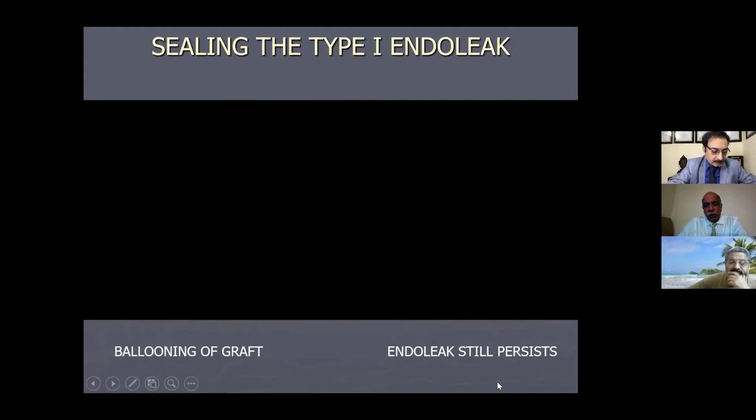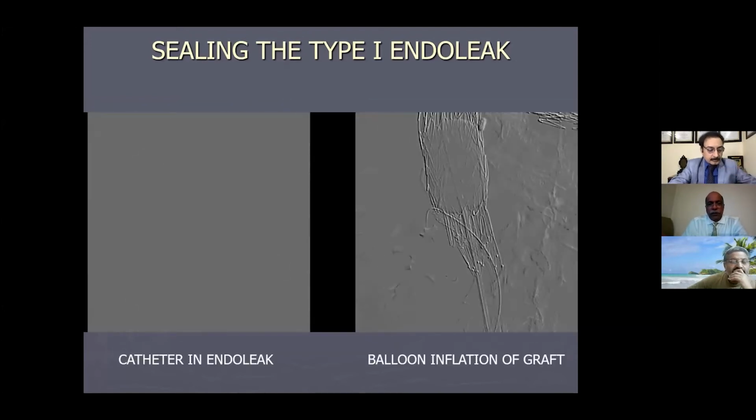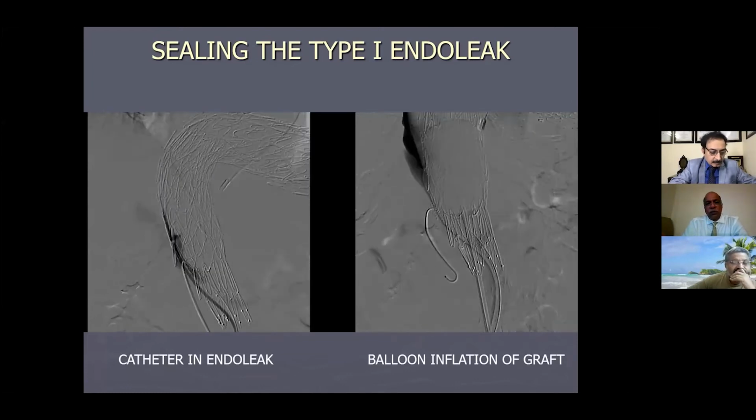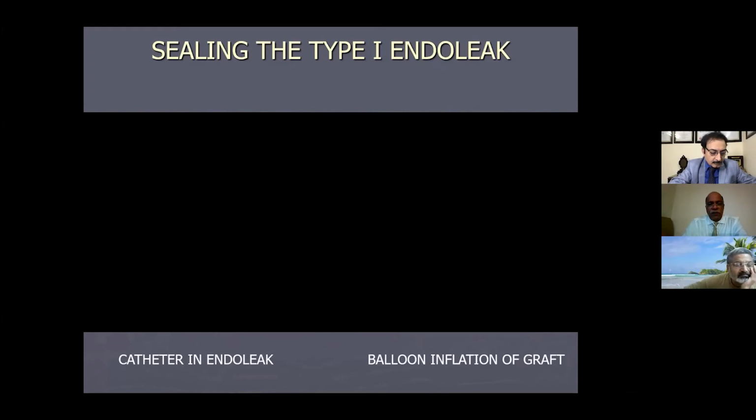Now we were in a fix. This guy has had multiple procedures. So we decided we'll go and seal it. So we used a balloon and said, let us balloon it again and see if it can help. Doesn't seem to be helping.